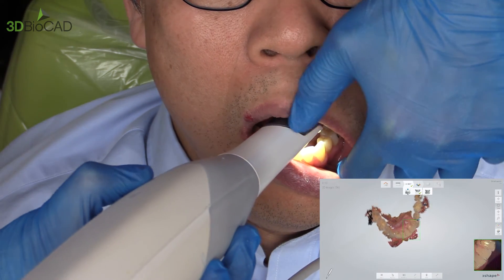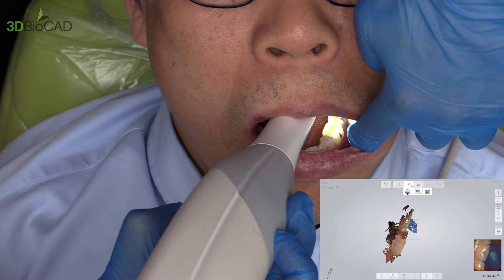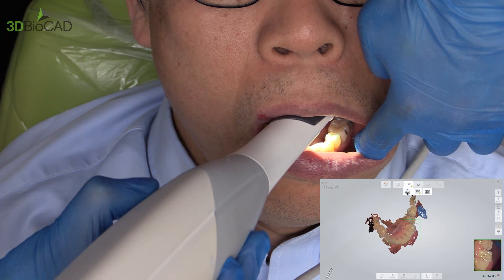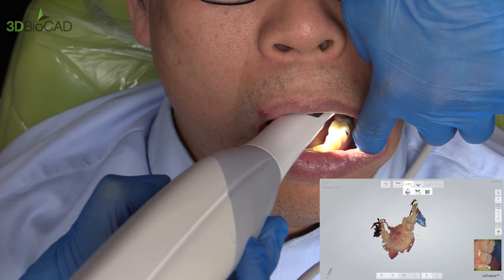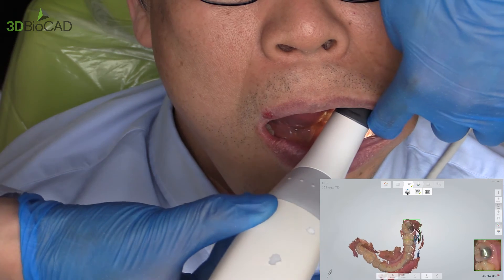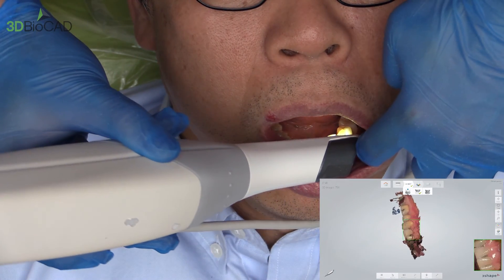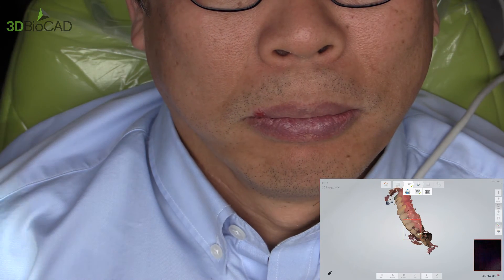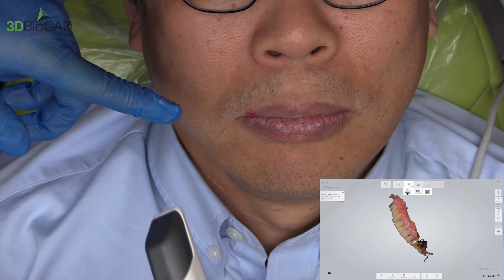Move your finger to another area and scan again. If you're not hearing anything, go back to where you were scanning — it'll capture again, then keep moving. Usually move the scanner a little slower. Rotate to facial. I stop here and have the patient relax, then go to the other side.